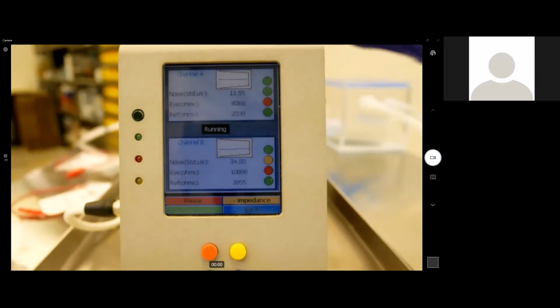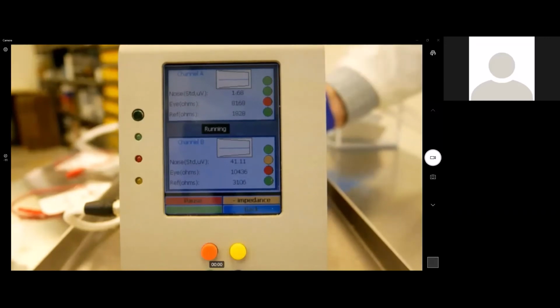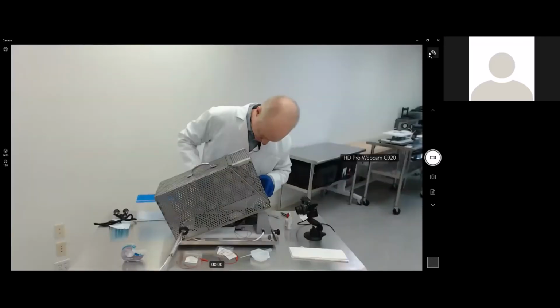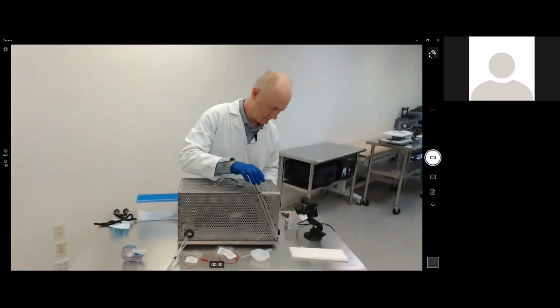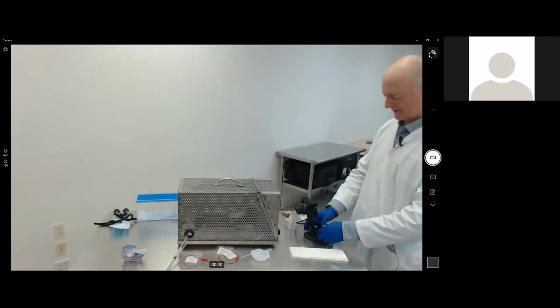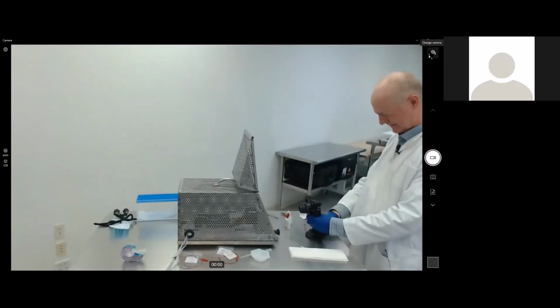So once we have the position and everything complete, we can slide the animal forward and put his head into the Ganzfeld dome. Okay, and then we will close the Faraday cage around the animal. Now I'll be careful not to knock any of the wires and make sure everything is settled in nicely inside the Faraday cage. And let me see, before I go to close-up, how's that? Look better?